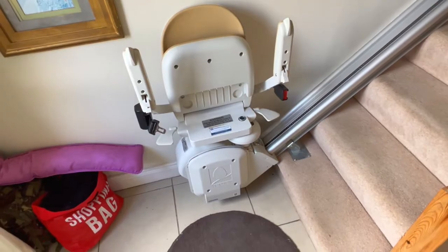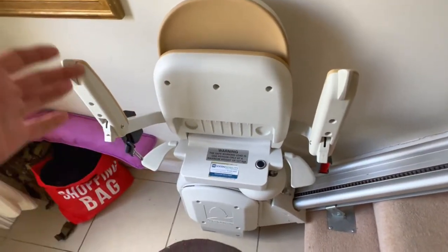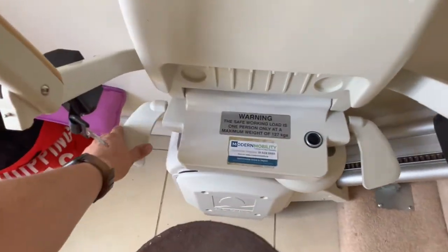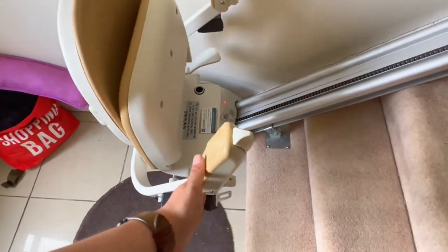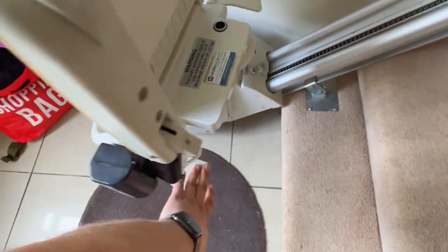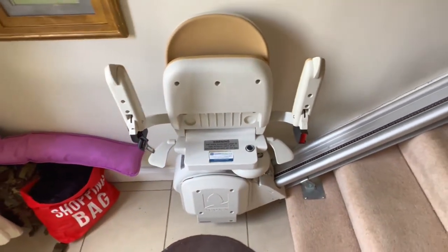Here's a more in-depth look at the swivel seat. While it's folded I can show you more easily — basically when you get to the top of the stairs, you push down this lever or that one and you can swing the seat around. It'll lock in at 45 degrees or also at 90 degrees. You must ensure that the seat is locked in before you get off, otherwise there's a chance the seat could swing back and you'd be going downstairs in a hurry.